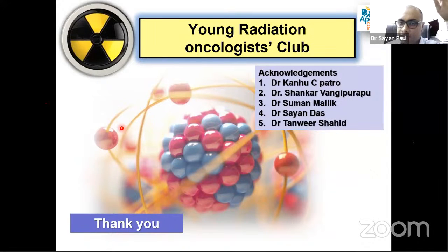That is only the translational direction. But a 6D couch can move in every direction. So it can correct the pitch, roll, and yaw. If you see the couch once, you will get to know how the couch moves. So you need a 6D couch to correct it, or you can use a Cyberknife.